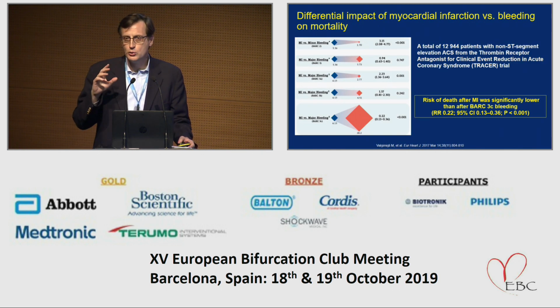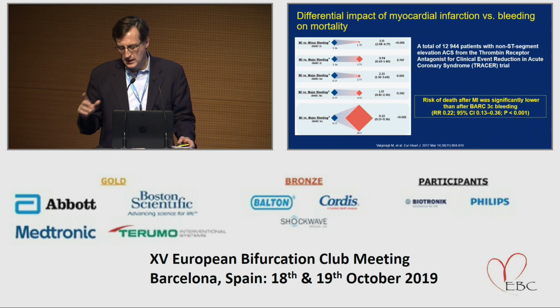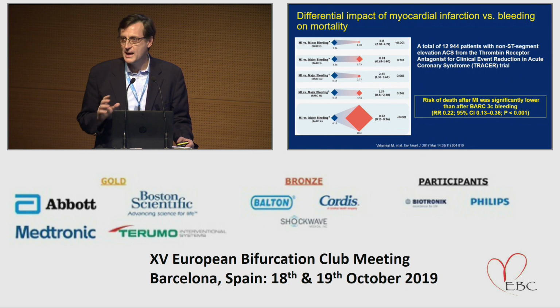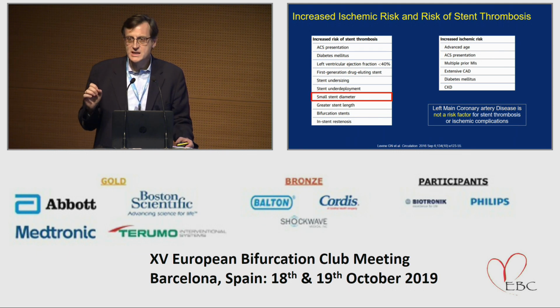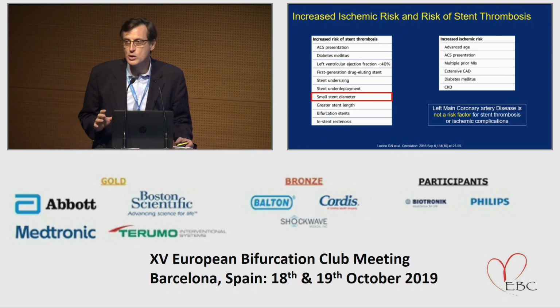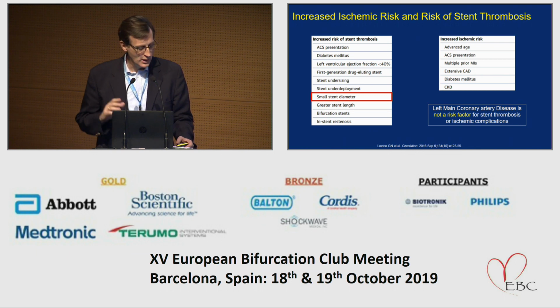And also, we need to understand that a patient having a small MI versus a patient having a transfusion for a bleed, the impact on mortality may be a little different. It's not exactly clear how much, but it may not be as traditionally associated mostly with the MI as we thought, maybe the opposite, and still an active investigation from all fronts. So, one of the risks for stent thrombosis, just to go to a little bit more technical aspect, is a small stent diameter. So I would say that left main doesn't exactly fit in this category, so we can go further.